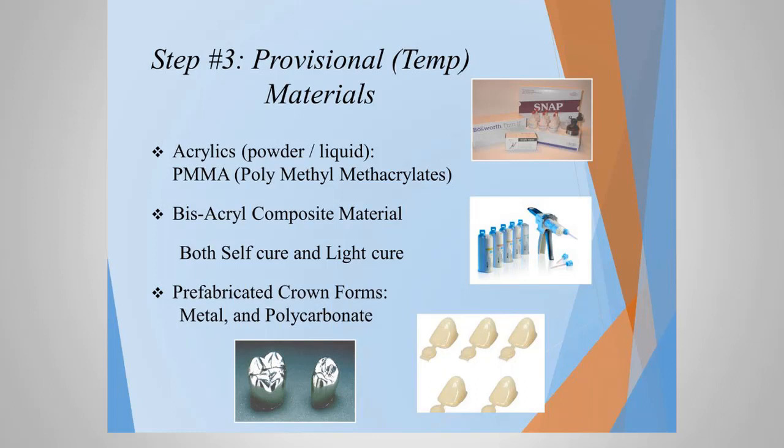Now, most people nowadays use the bis-acryls, which are composite-based materials. Most of them are self-curing and also can be light-cured to speed up that curing process, to cut down on the amount of time that you're waiting for these materials to get hard and to start polishing them.